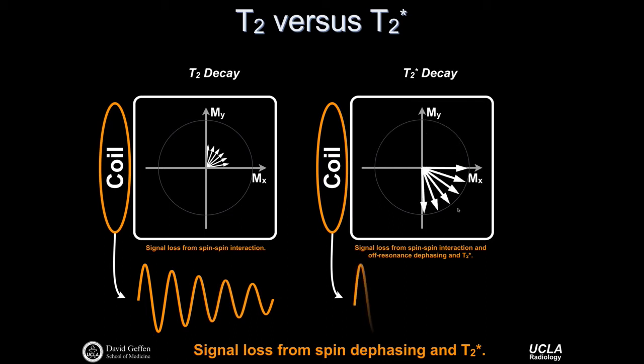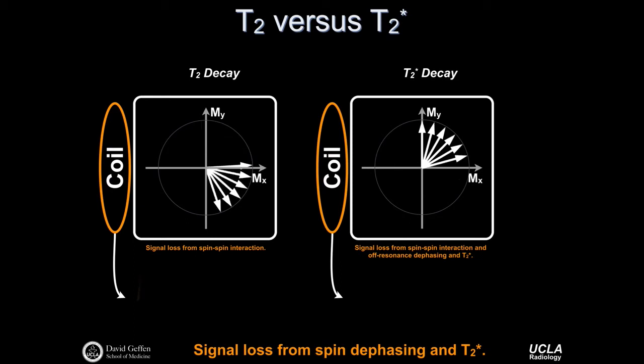So here the distinction is that the spins are going to precess, generate a transverse magnetization that we can detect with a nearby coil, but the spins are not only decreasing in magnitude, they're falling out of phase with one another. Sorry, in just a second we'll advance to this video on the right-hand side.